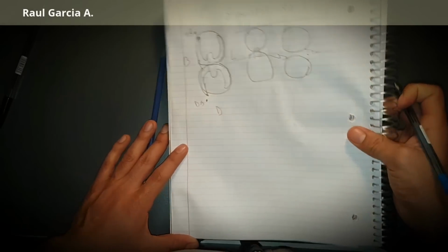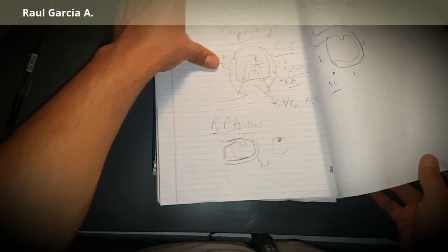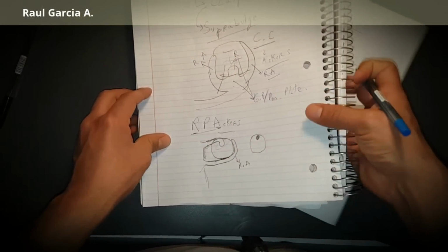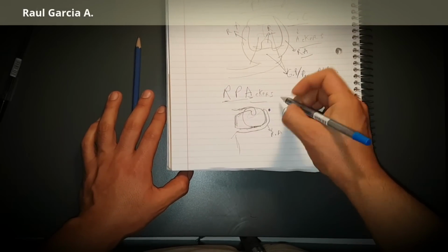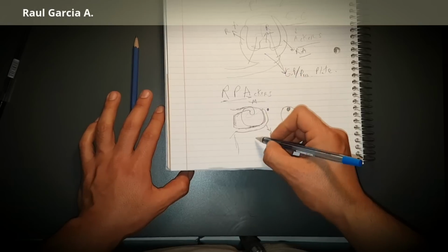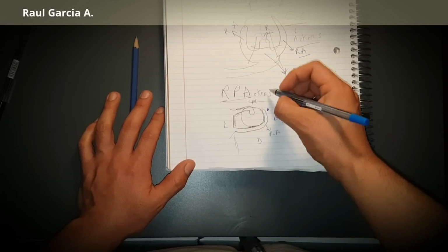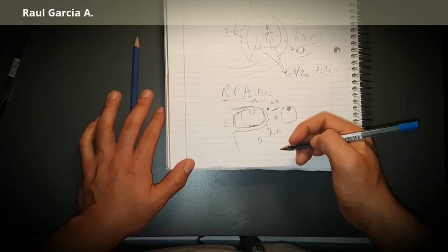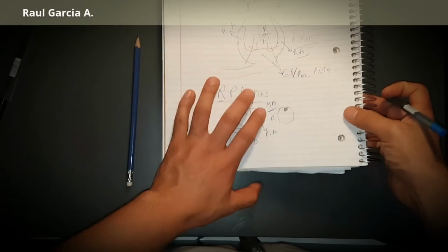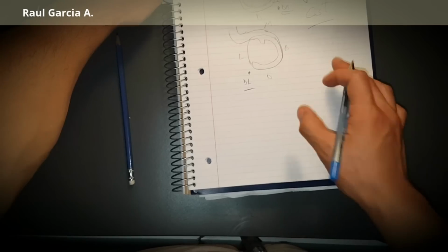Good. Now, I mentioned the RPA. So when we use the RPA, basically, we're engaging the mesial. Let's say this is mesial, this is distal, this is buccal, and this is lingual. So we're engaging a mesial buccal undercut with an RPA. Okay? Now, that was the back action. And then we saw the embrasure.